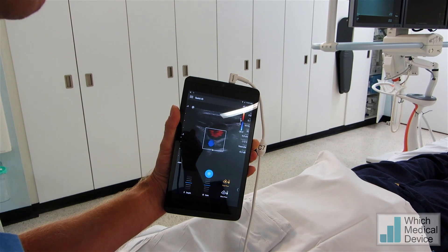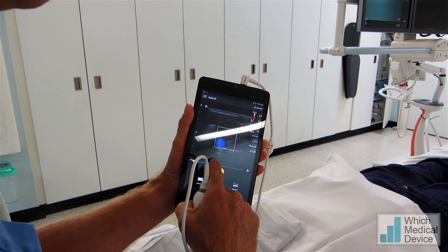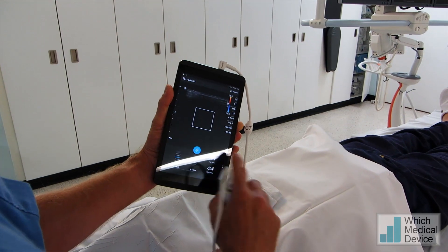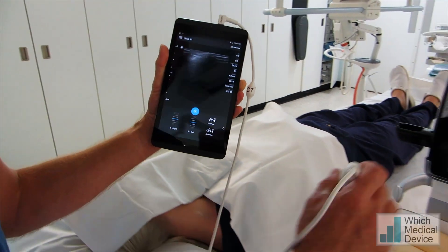We can record cine loops, we can freeze frame. If I freeze frame now, I can scroll back through. We'll just unfreeze, take the Doppler off, go back to greyscale imaging. Now let's quickly have a look at some of the other machines and see how they compare.